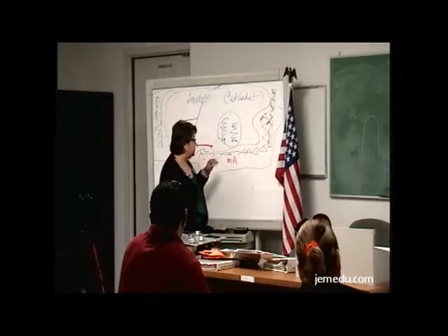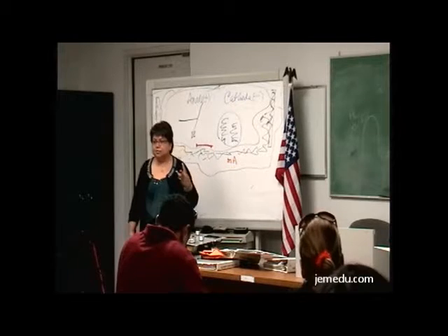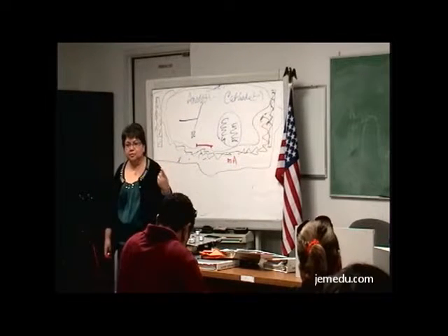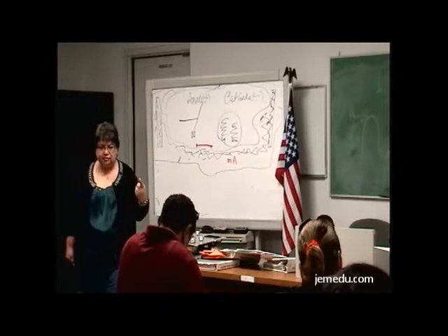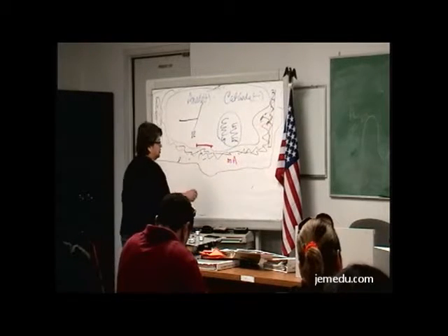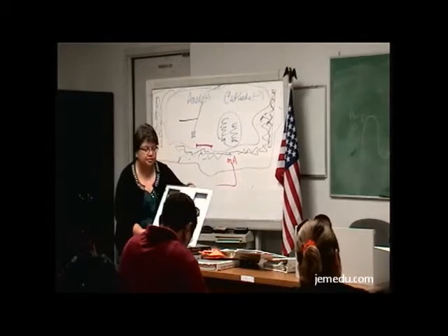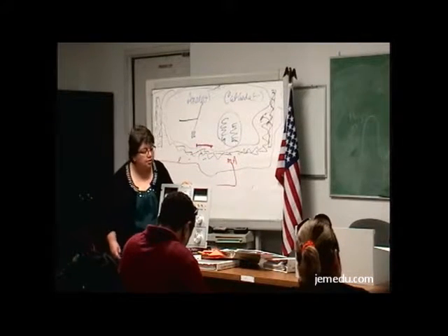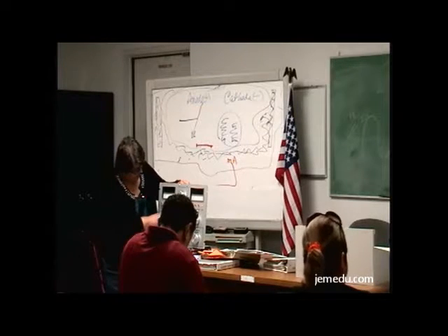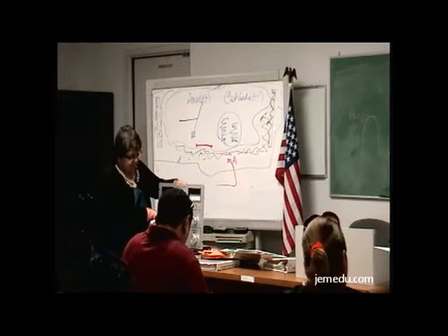Alright, so we need three major things in order to make X-rays. The first thing we need is a source of electrons. And where we get our source of electrons is milliamperage. So when you walk to your X-ray console, you're going to select what milliamperage station, whether you have 50, 100.